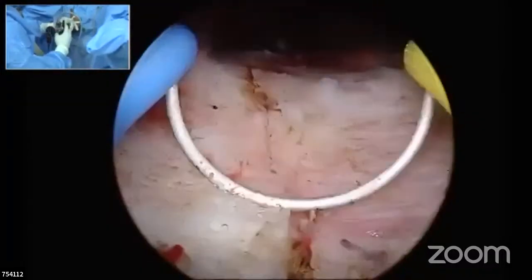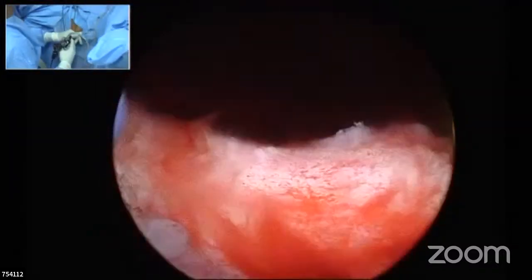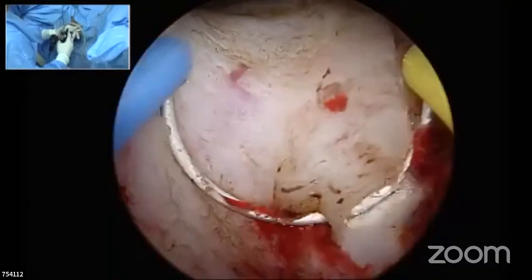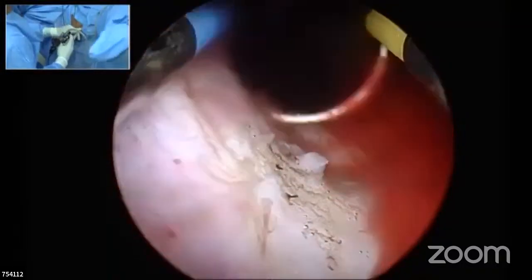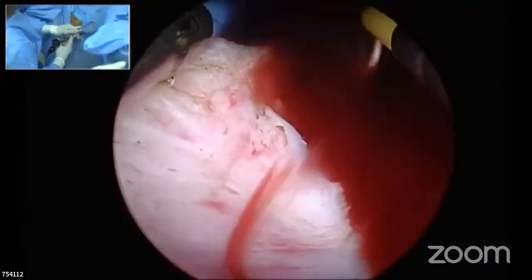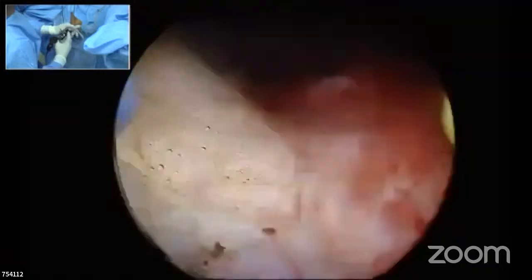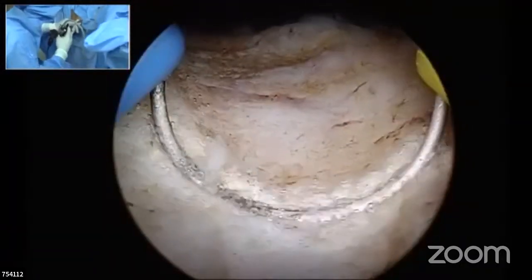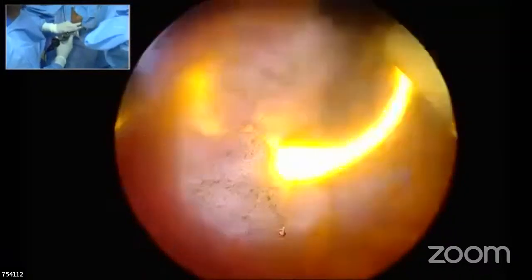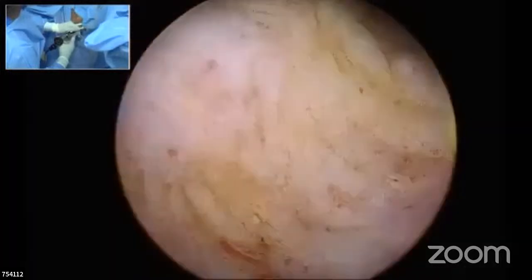So the most common areas of postoperative bleeds are small bleeders from the prostatic tissue. The prostatic tissue itself doesn't bleed. The major bleeders are between the bladder neck fibers and the prostatic tissue. That's where the major vessels enter the prostate. So try to look into that area and have good control of those vessels. This is the bladder neck, and this is the prostatic, and this is the junction. So look for bleeders at that point and try to resect all these bumps, and don't bother about the crevices, but bother about the bumps and resect them.